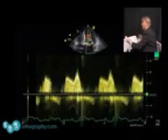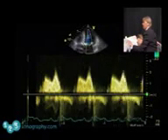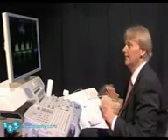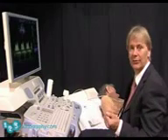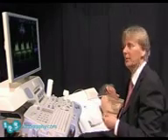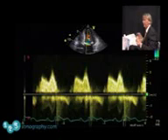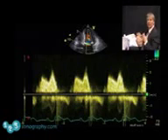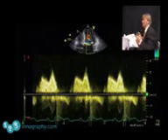Okay, this is a better signal. So the problem we have here, we can see that immediately, is that the A wave is taller than the E wave. So we have impaired relaxation, some form of diastolic dysfunction, and in this setting, we cannot use pressure halftime. So this will leave us with the question, what is the mean gradient?